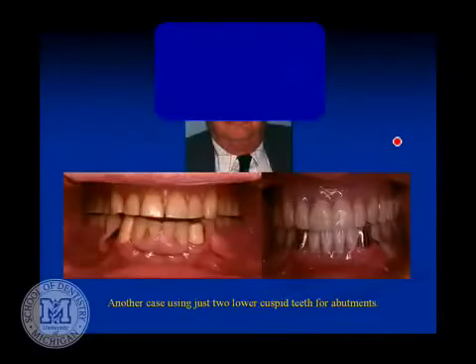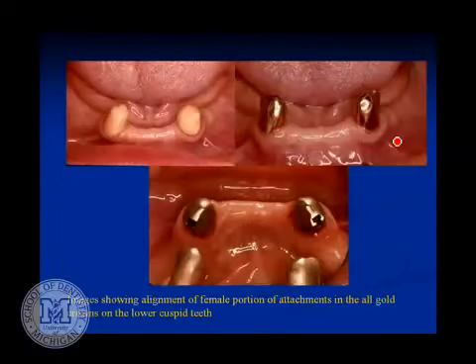Different patient. This individual, a nice older gentleman, said he didn't care at all about the aesthetics of the teeth, so he had two cuspids left, two eye teeth, 22 and 27, and an old beat-up partial denture that didn't even have clasps on it. So we went ahead and made a new denture, a precision partial, and then after we had these crowns done, he decided, gee, maybe they are a little shiny, maybe I don't want them quite that shiny. So we took a sandblaster and dusted them down, so this is after they'd been sandblasted, and they didn't seem quite so bright.